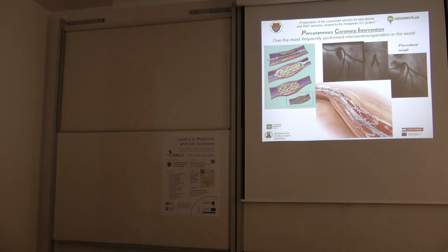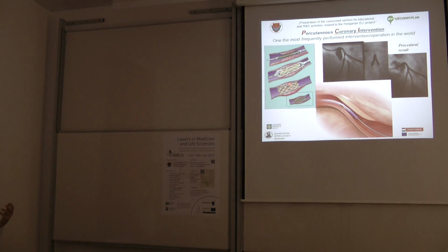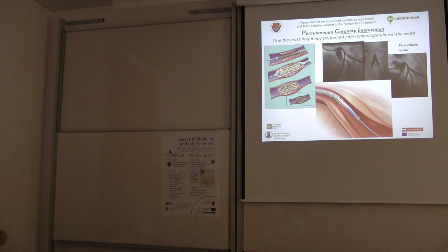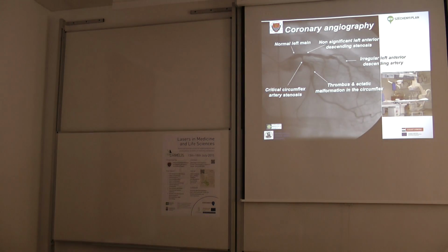Most likely OCT will be used for the diagnosis, to see what's going on inside the artery, or for the procedure itself, the dilatation of the obstruction of the epicardial coronary artery, and the implantation and deployment of the so-called coronary stent, which is a metallic prosthesis that remains there for the rest of the patient's life. But it's a very safe procedure and a long-lasting solution.